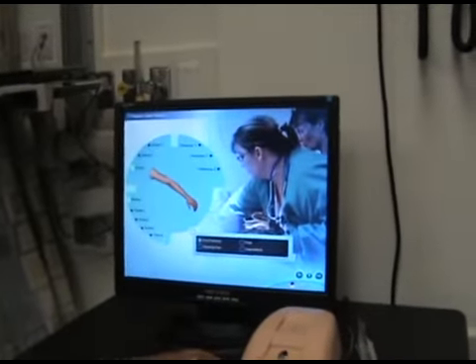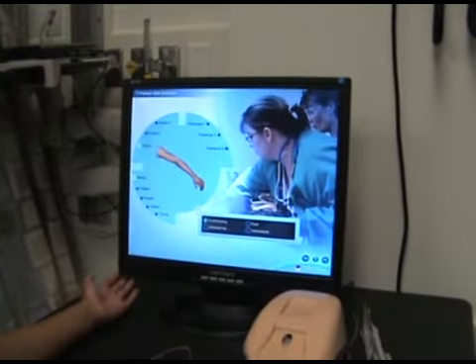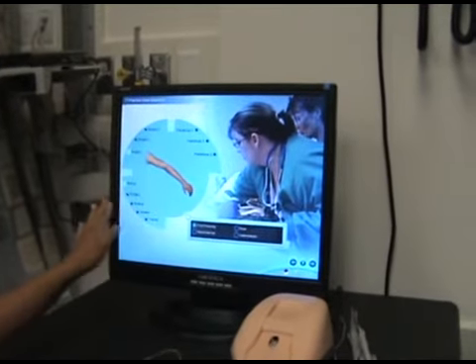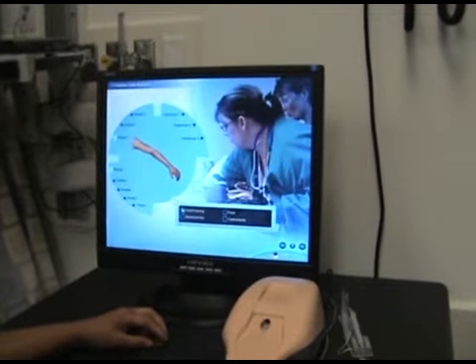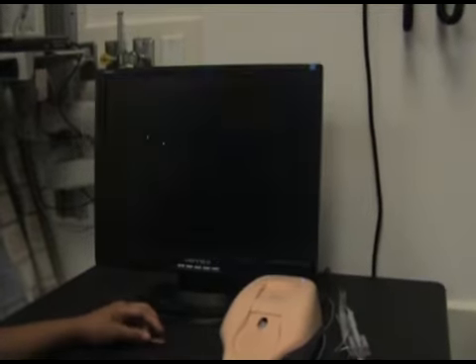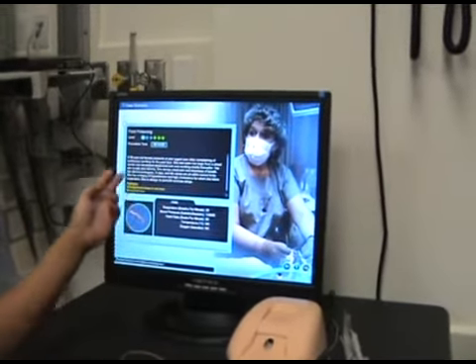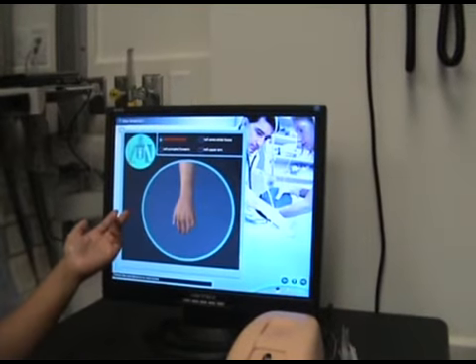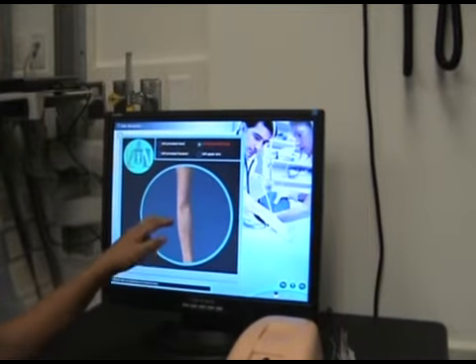This is where you actually choose the scenarios you want to do. For example, you could choose to be a student or a practitioner. You have 5 different fields: medical, pediatric, surgical, geriatric, or trauma. And you could choose whether you want an abdominal pain patient or a fever patient. Then it gives you the scenario and vital signs, and from that scenario you choose which side IV you want, like the left pronated forearm, or the left AC.